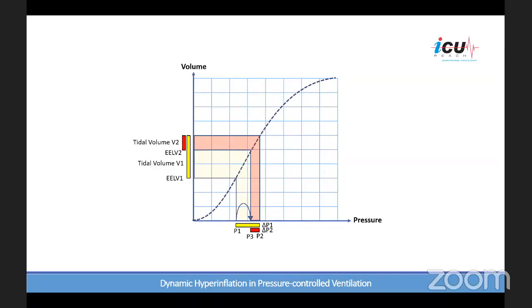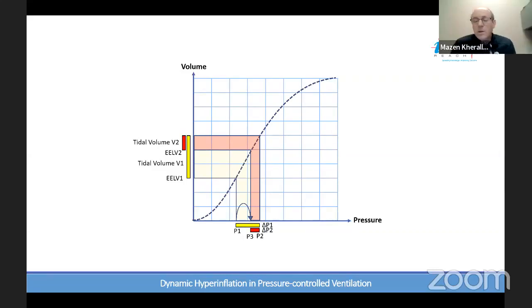So one of the other questions is, what is the effect of putting a PEEP of 0? Well, it has nothing to do with the generation or building up of dynamic hyperinflation syndrome. However, by putting the PEEP to 0, you can easily get to that level where it can stop.